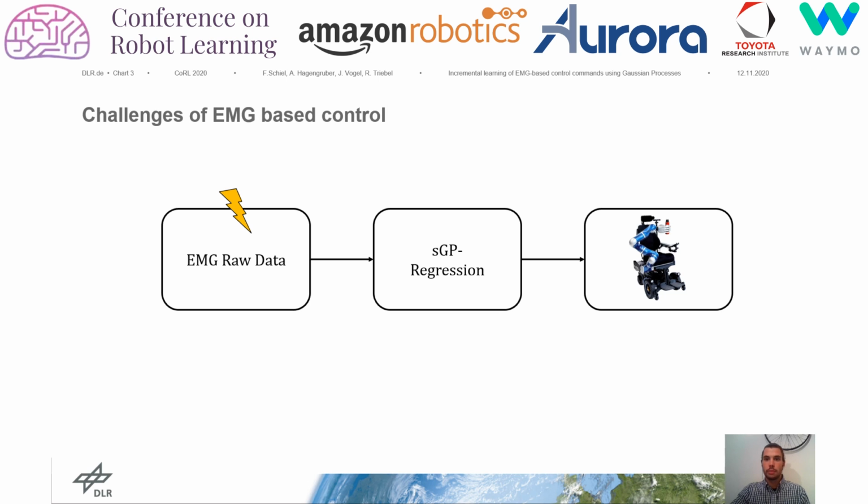Pattern recognition in myoelectric control is a very challenging field, since the underlying distribution of the signal is likely to change during the application. Changes of the arm position, sweating, or different levels of muscular activation often lead to significant instability of the control signal. To overcome the challenges and to regain a satisfying performance, we propose an adaptive approach which updates the sparse GPs during runtime.